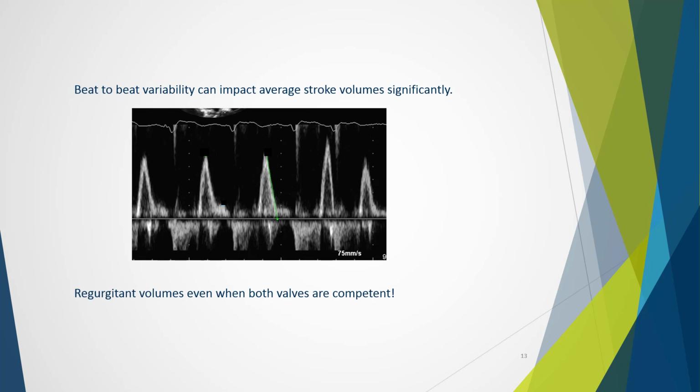We must be aware that there is beat-to-beat variability. Even in someone with sinus rhythm, there is a slight deviation in heart rate and therefore stroke volumes, with accordingly slightly different ventricular fillings. Multiple tracings are required. In someone with sinus arrhythmia, atrial fibrillation, or ventricular bigeminy, for example, even greater numbers are required to derive a true representation of the average stroke volume.